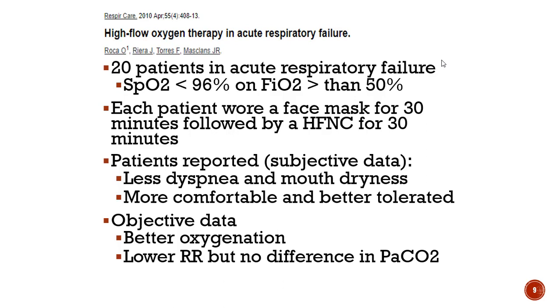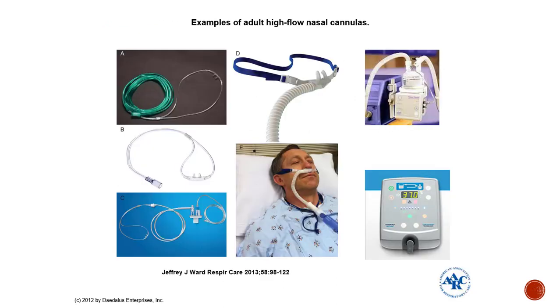Don't ever think that this is a substitute for BiPAP. It's also really not one that we use as a substitute for CPAP in a lot of situations where work of breathing is pretty high or fluid overload is a consideration. I just want you to realize that this is an added benefit to the high flow nasal cannula. It's definitely not the main usage of a high flow nasal cannula, and you would never, ever, ever use it to treat an irregular CO2 or a high CO2.